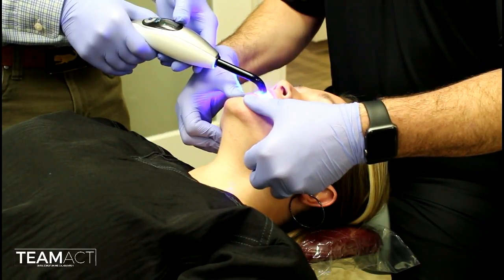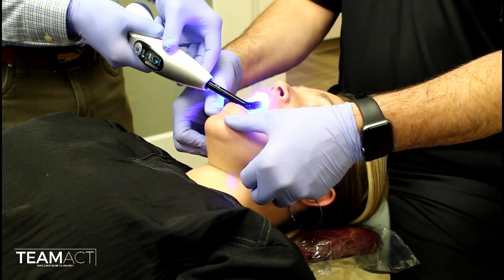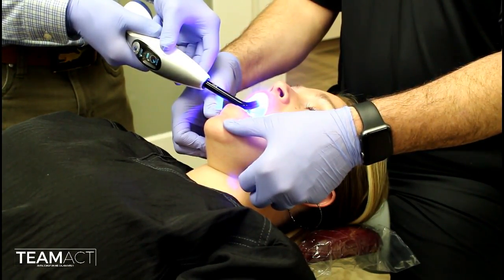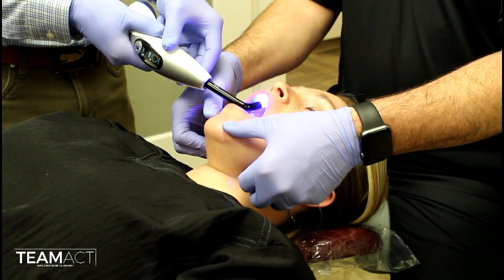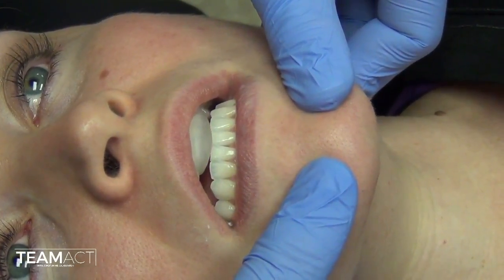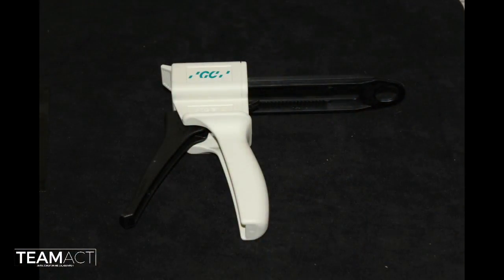Once it is set, I will guide the patient through that series of movements again to ensure it is in the proper position. As you can see, the patient closes right into that jig that we have just made.